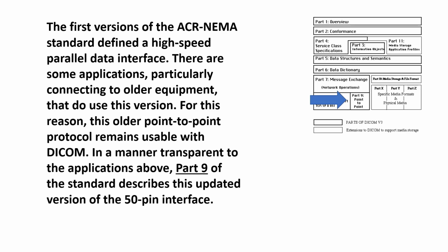To allow connection to older equipment, DICOM had Part 9, which was a description of how the devices would directly plug into each other, or point-to-point protocols.